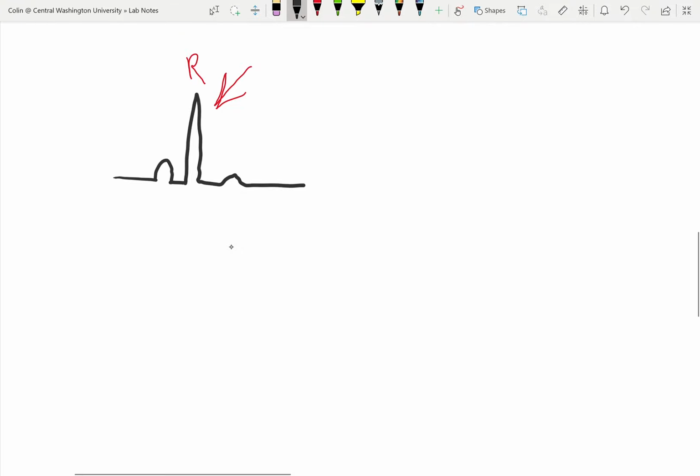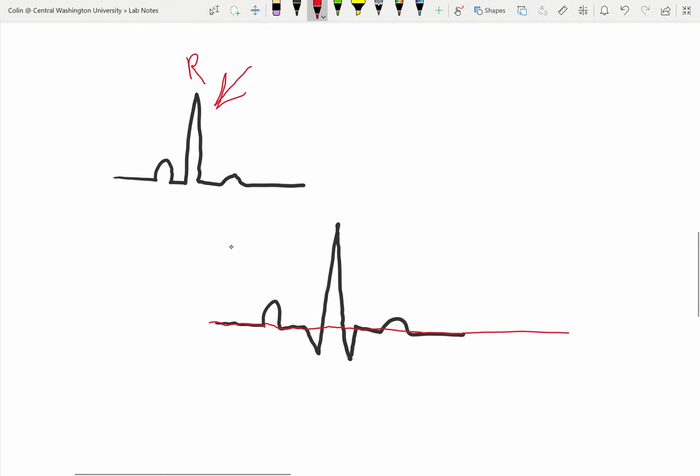So it's possible for it to look like this. P wave, then it goes negative, comes back up, it goes negative again, and then a T wave. And so there's actually three waves here. And I'm going to draw, so like we were talking about, this is the baseline, right? No electrical activity. And the baseline actually goes all the way through our whole complex. Okay? Now it should be a little more obvious.